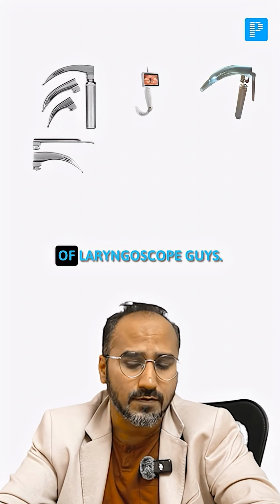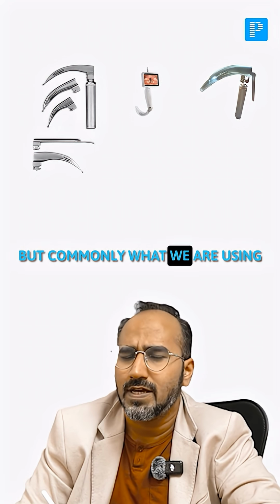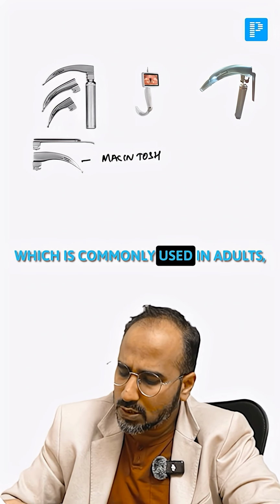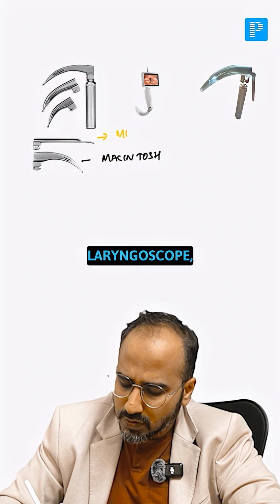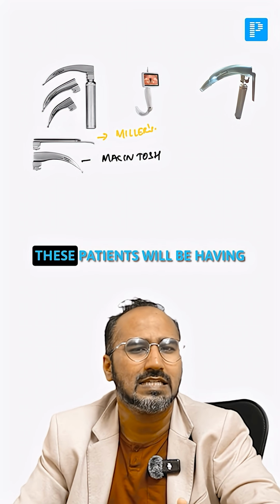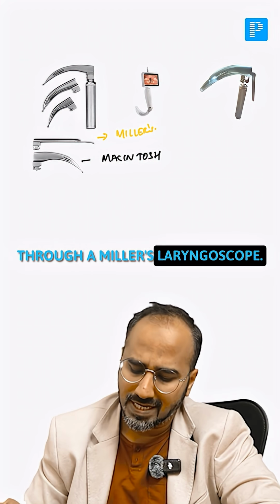Now what are the types of laryngoscope, guys? Remember, we have many laryngoscopes, but commonly what we use is a curved blade laryngoscope, which is called the Macintosh laryngoscope, which is commonly used in adults, and a straight blade laryngoscope, which is called Miller's laryngoscope, which is commonly used in pediatrics. Why? Because pediatric patients have a large epiglottis, which can be easily lifted with a Miller's laryngoscope.